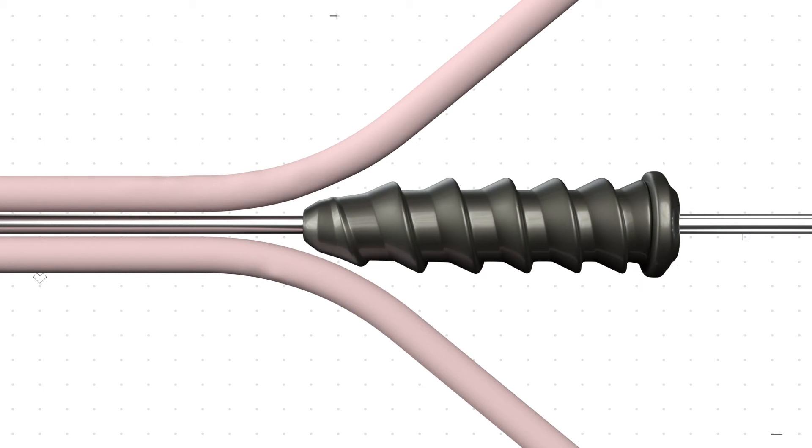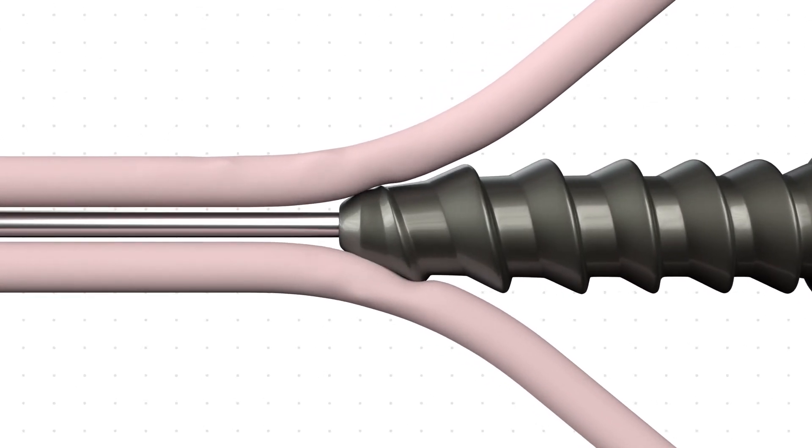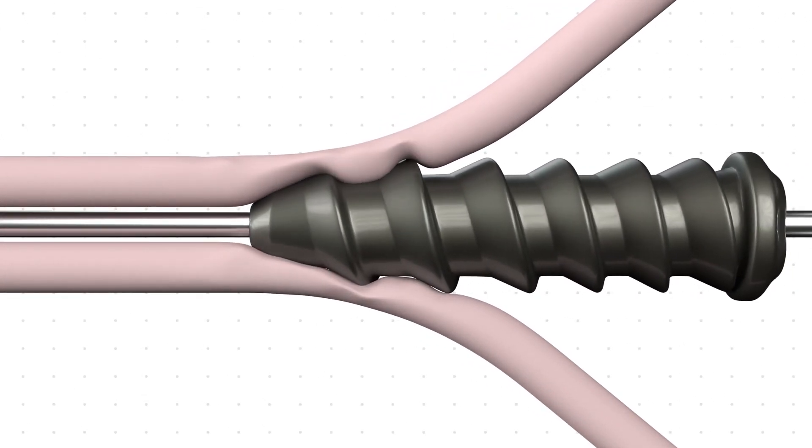While securing the screw, the blunt thread edges firmly press the graft against the bone without damaging it.